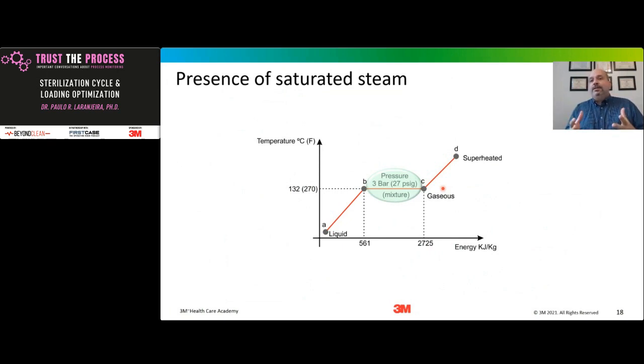With dry heat, we don't have latent heat, so we only have temperature. People that used dry heat in the past will recall that we needed higher temperatures for a longer time to inactivate all the spores. Therefore, if I have superheated steam, I will not be able to inactivate spores in a 4-minute exposure. Okay?